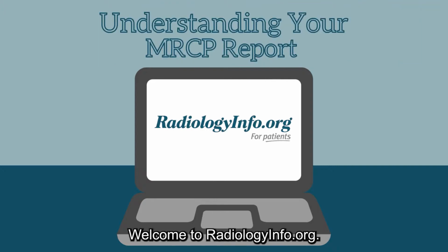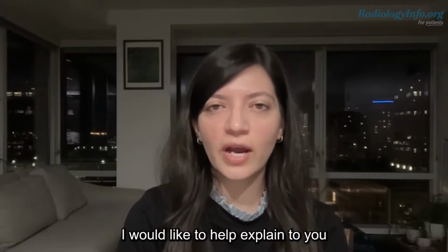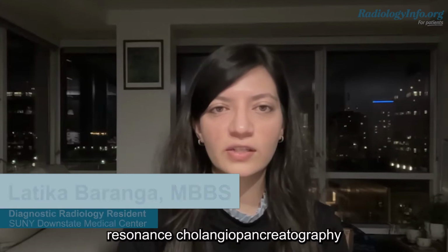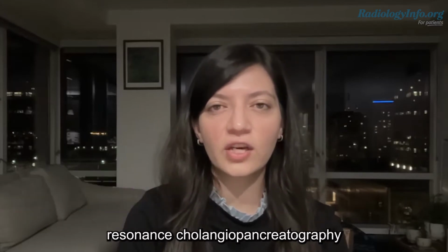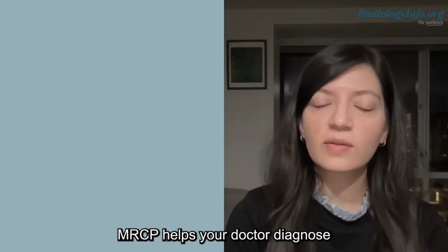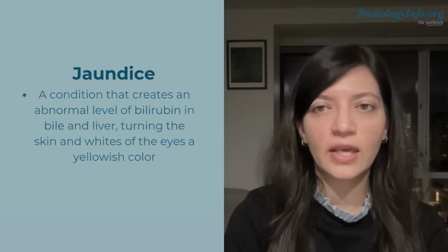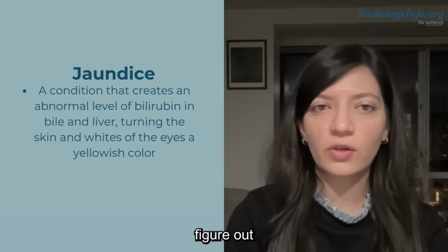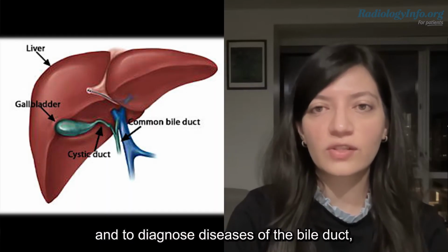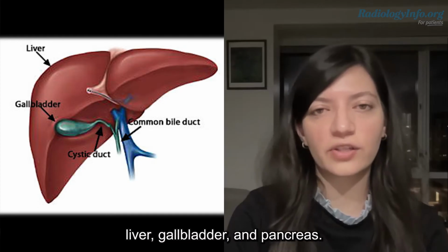Welcome to radiologyinfo.org. In this short video, I would like to help explain to you how to read your magnetic resonance cholangiopancreatography, or MRCP, report. MRCP helps your doctor diagnose the cause of abdominal pain and jaundice. The test also helps figure out the cause of an abnormal liver function test and to diagnose diseases of the bile duct, liver, gallbladder, and pancreas.